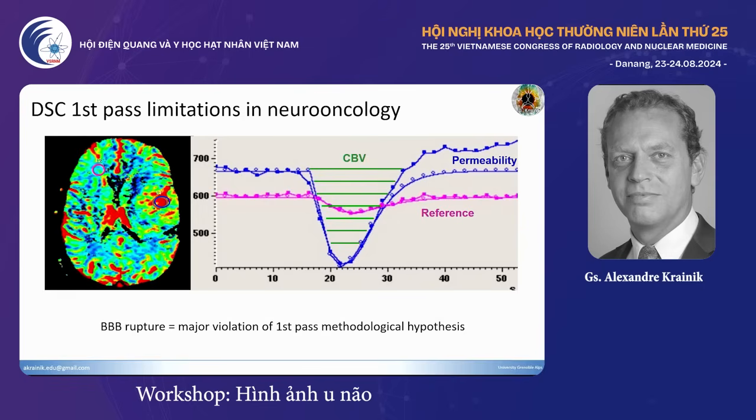And when the bolus gets out of the vessel, at 1.5 Tesla, you have a T1 effect, meaning that your signal after the bolus will be higher, even on T2 star, than before during the baseline. And at 3 Tesla, there's no or very poor T1 effect. It's usually T2 star.